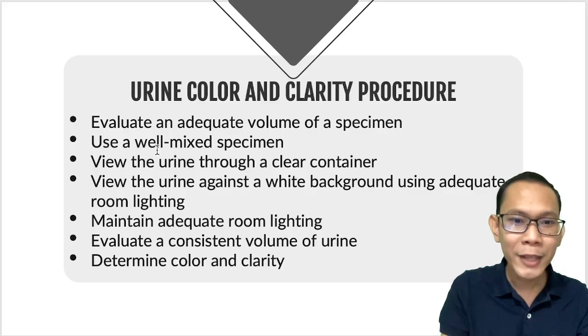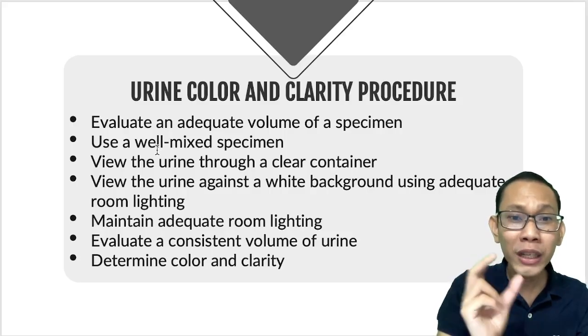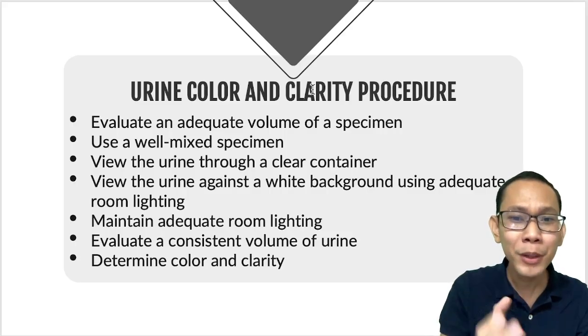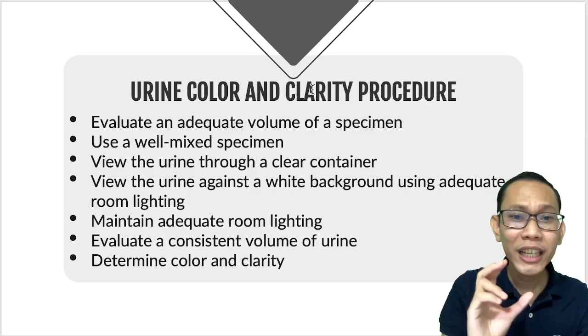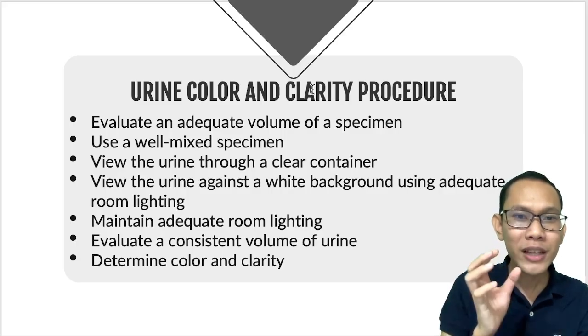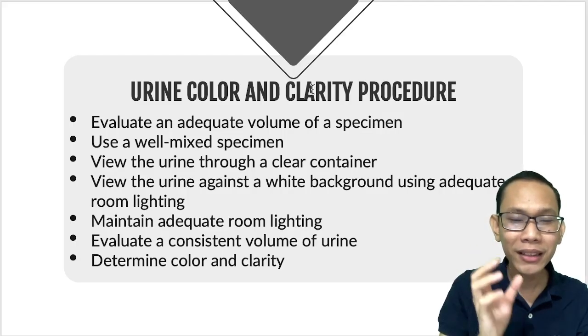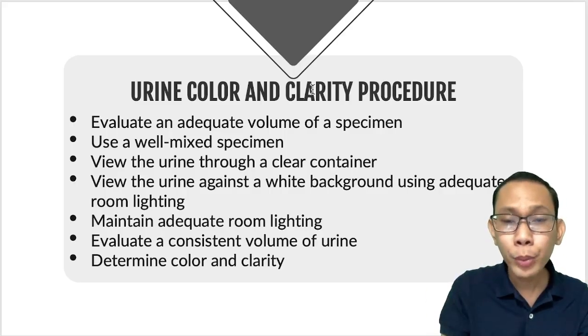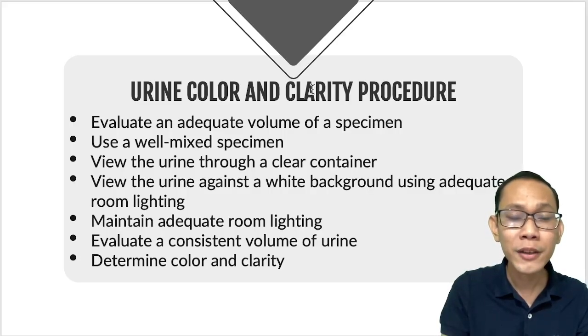And then, again, use a well-mixed specimen. So again, you have to thoroughly mix the specimen before identifying the color and the clarity, most especially the clarity na part. Because what will happen? Remember, there are sediments in your urine. So, for example, nag-turbid ang specimen natin because there are a lot of sediments, but you were not able to process the urine sample as soon as possible because there are so many things to do.